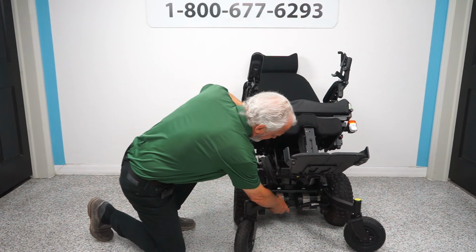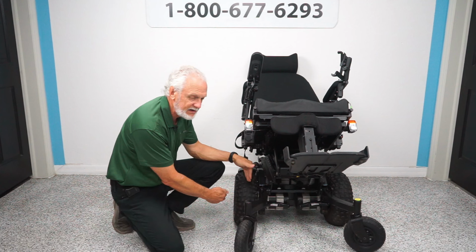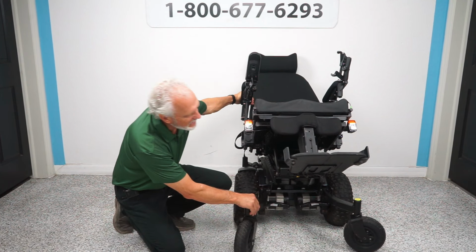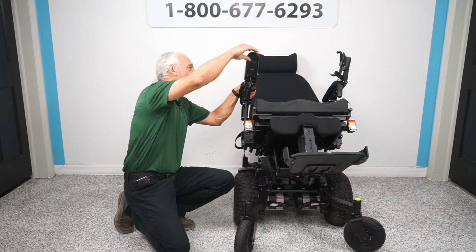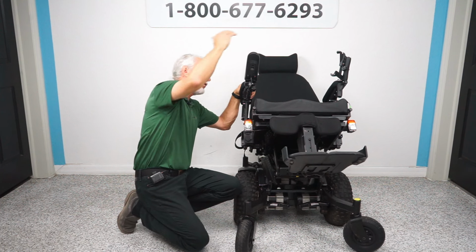There's a huge motor for this wheel. There's a huge motor for that wheel. So those motors are directly connected to the wheel. There's no chain, no belt. If I want to push this chair, let's just say I want to roll it, well, you would turn the power off because these are electric motors. So you want the power off.